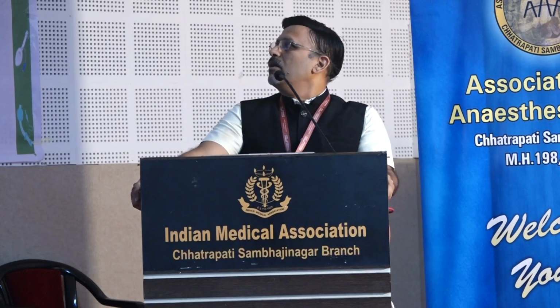Lastly, 2 slides. This is a 26-year-old female, Telugu speaking, 48 kg, no criteria of difficult intubation as such, only a previous history of adenotonsillectomy. On laryngoscopy, the view was like this, nothing is visible. Then we tried with fiberoptic, a small slit and trachea could be visible, and the diagnosis was oropharyngeal stenosis.